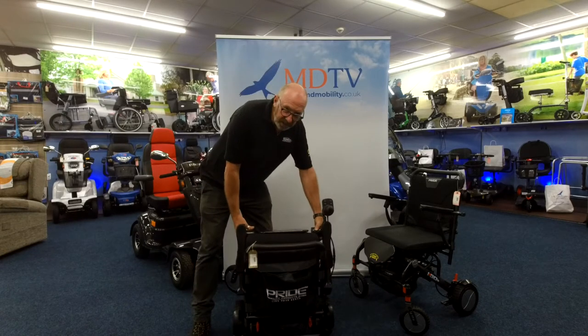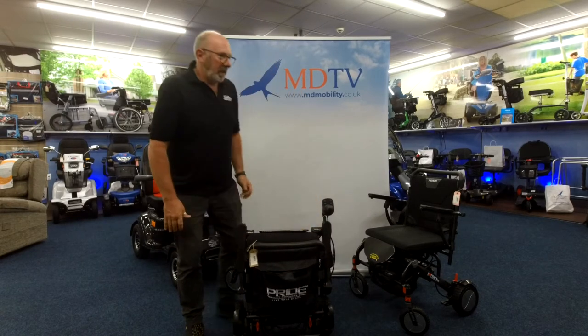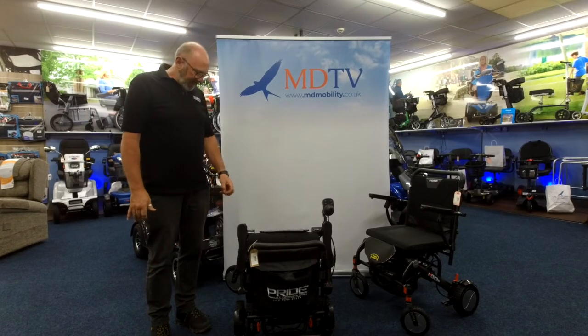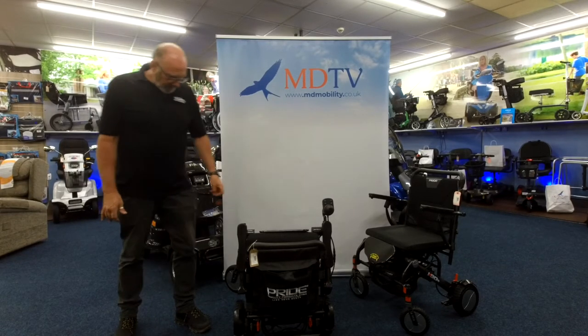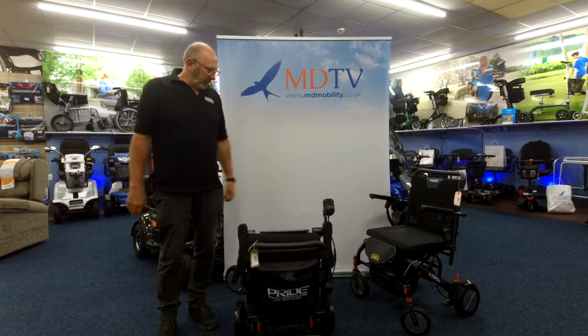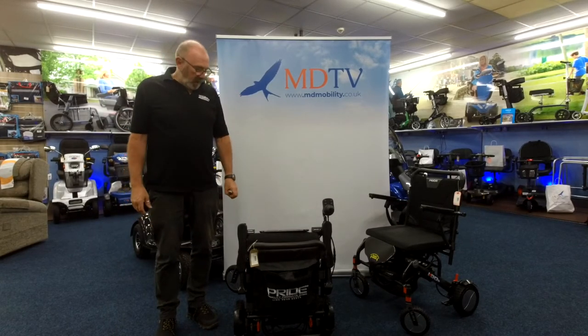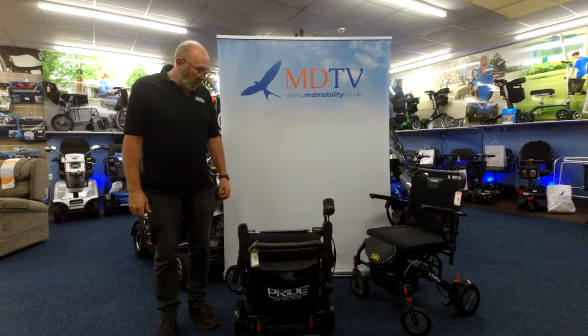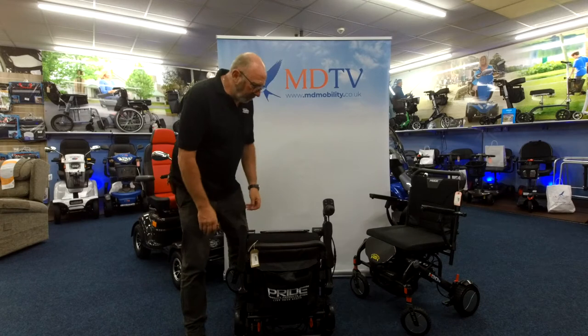Hello everybody, welcome back to MDTV. It's been a little while and we haven't had much to show you, but we're back onto these again — it's the Pride iGo Lite. The reason we haven't been saying too much about them is because nobody's had any stock. The good news is we have quite a few of these in stock now, plenty to go.